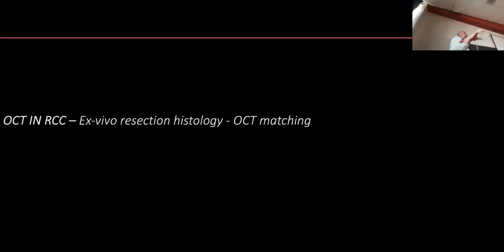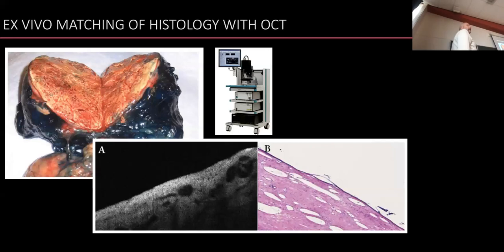So already in the beginning, I showed you the possible application in the kidney. And you asked the question, okay, patient on the side, how does it look? We already go into the kidney to take a biopsy with a needle, and we already go there to treat it with a needle. So if we have a technology that's fast, or actually real time, and allows us to do diagnosis on it, you have what we call a one-stop shop. You come in as a patient, and by the end of the day, you're a treated patient.